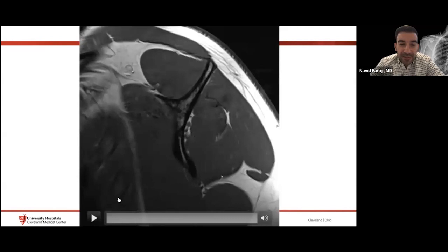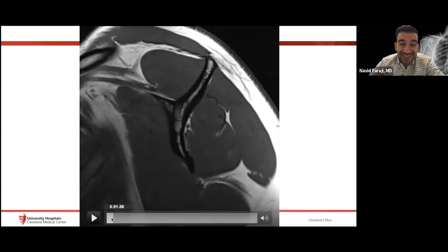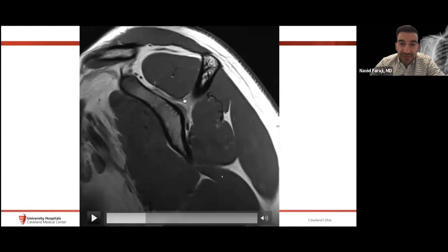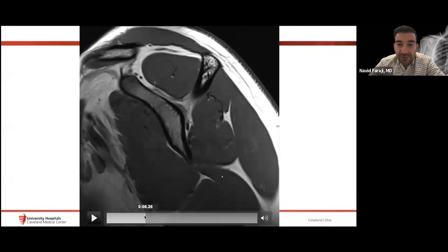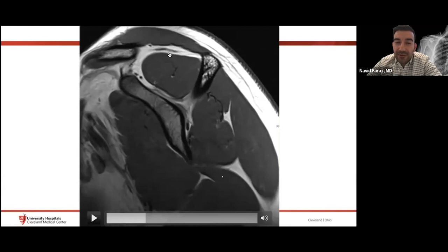On the sagittal plane, we use a fat-sensitive (non-fat-saturated) sequence because we want to quantify the degree of fatty atrophy of the musculature — fatty atrophy has a prognostic implication. We need to assess both the volume of muscle within the fossa and the amount of fatty infiltration. This is important for surgical planning, and we'll discuss the grading systems for this later.